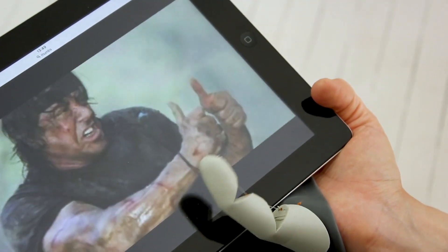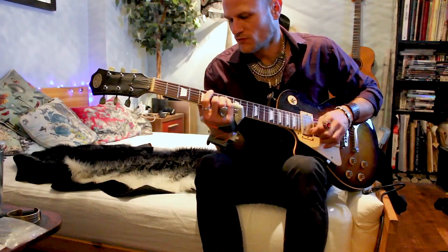Imagine if you had an extra thumb — the amazing things you would be able to do, like play the guitar faster, or eat a bag of chips with one hand. It's delicious.